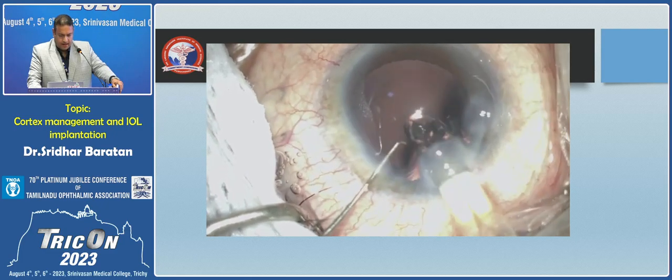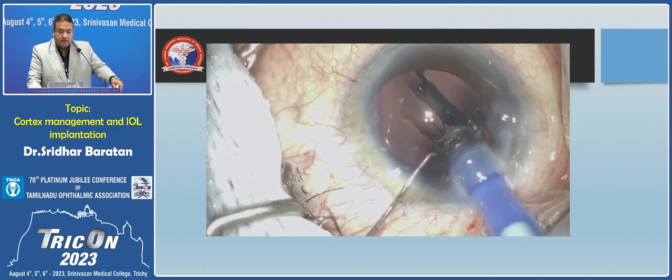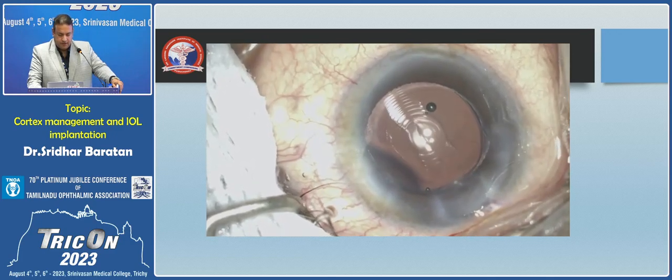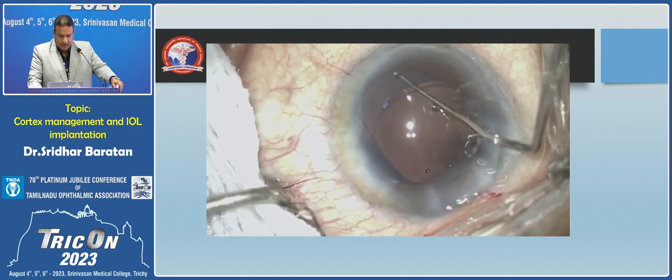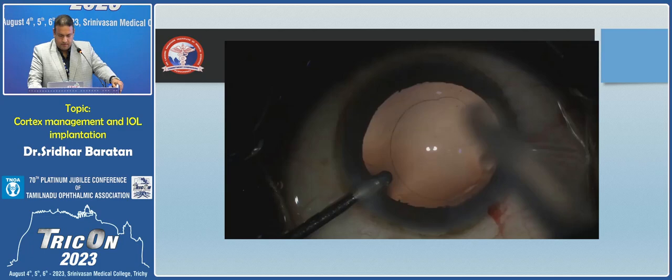This is being done under Visco, so you can see the haptics coming out horizontally, and then you use your second instrument to gently tuck in the trailing haptic as well. So that's how it's done. You can make sure that everything is properly tucked in.